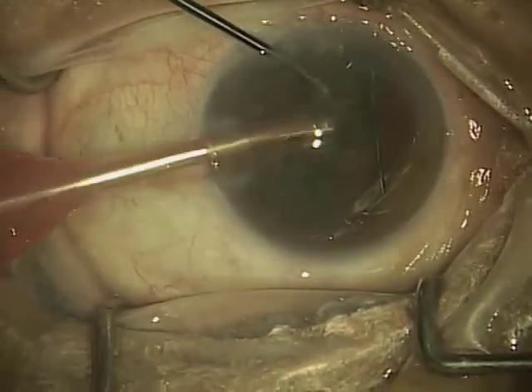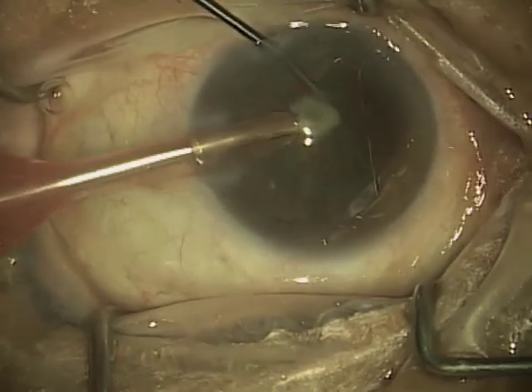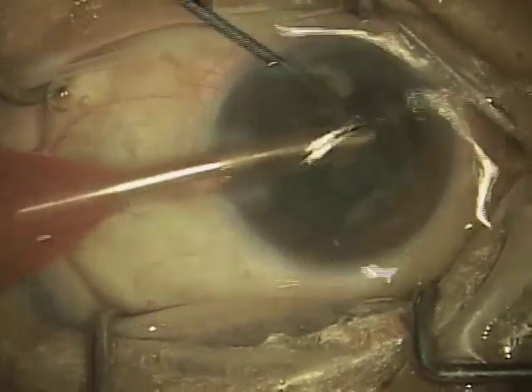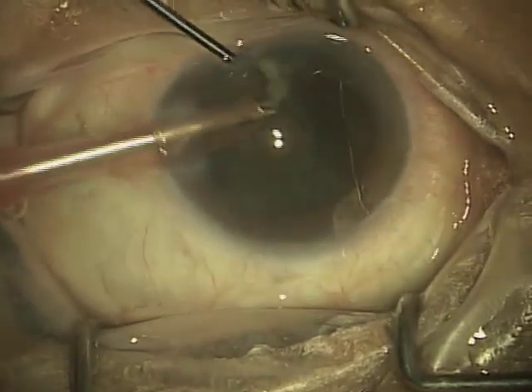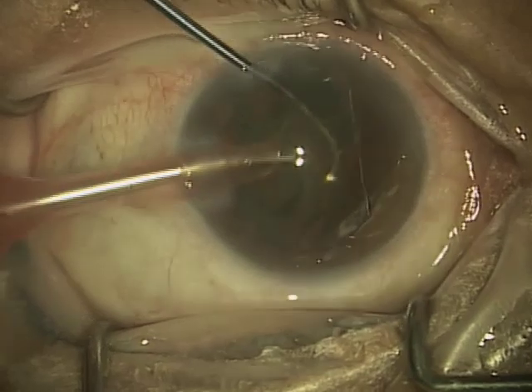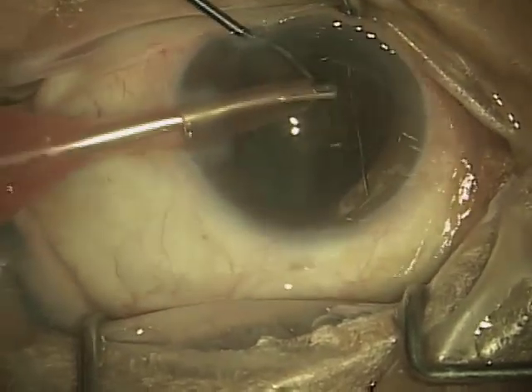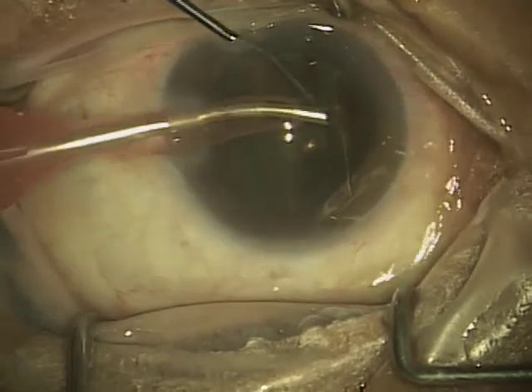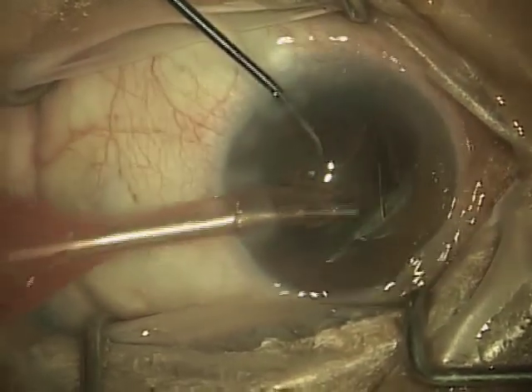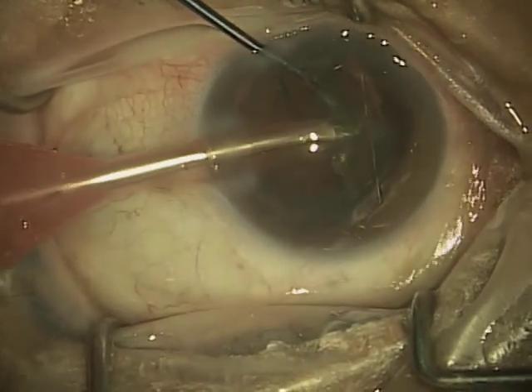Now what I'm doing is removing what's called the epinucleus — that's the soft layer created by the hydrodelineation step, and this rolls up into the tip. This is actually a relatively risky step because it is very, very soft, and if it gets vacuumed up too quickly, the capsule is right on the other side of it. The phacoemulsification tip can actually cut a hole in the capsule — remember, it's very, very small. So I use my second instrument and position it between the tip of the ultrasound and the capsule itself.